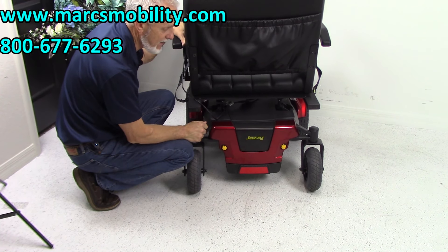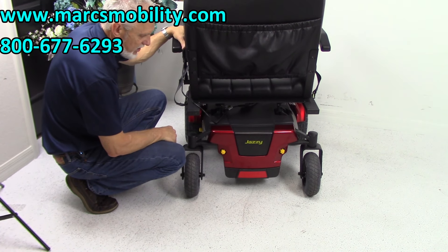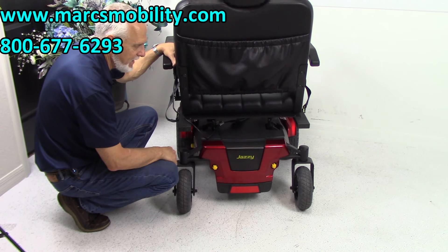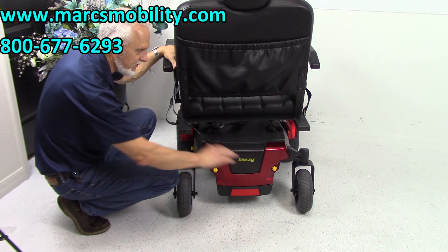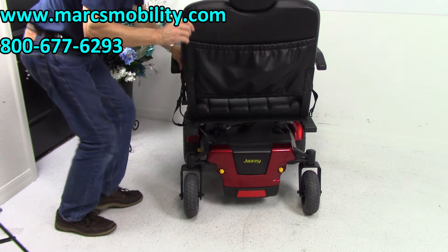These are 75-amp batteries, which will give you about 14 to 15 miles per charge. That mileage depends on the weight of the user and the terrain — flat surface, grass, or uphill — so you might get less or more. It's not set in stone.